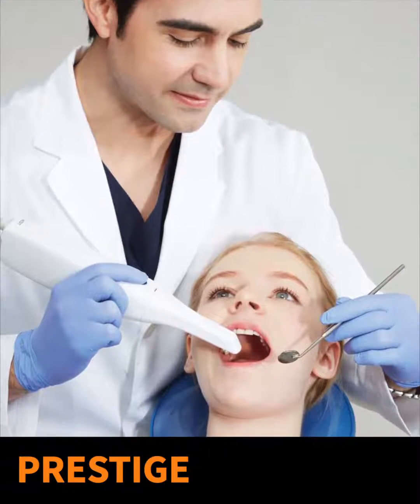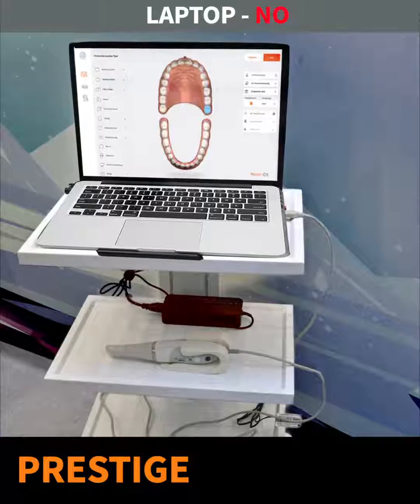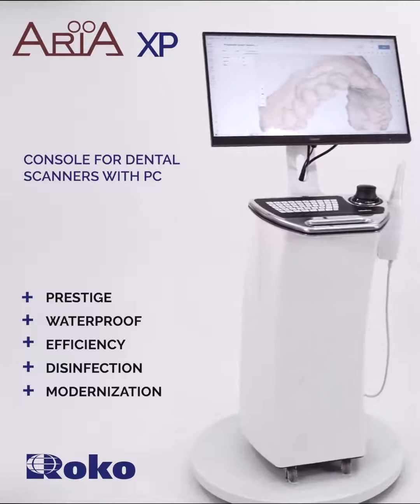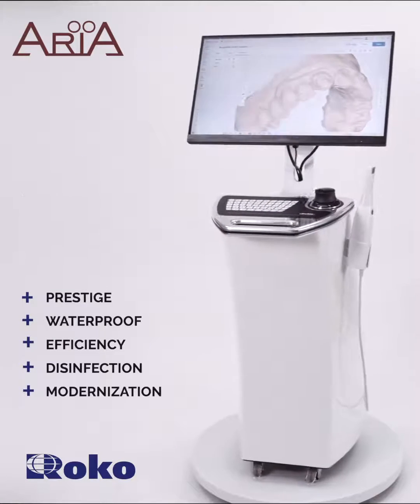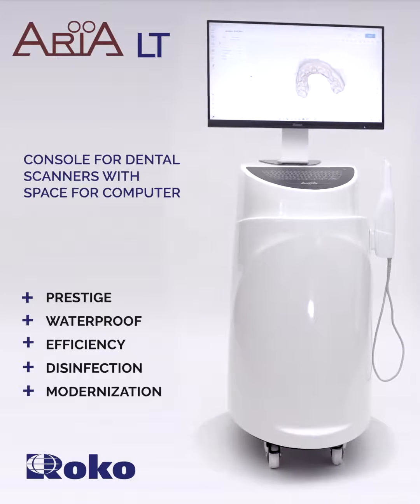Intraoral scanners mean easy work, but prestige too. Even the most expensive laptop will not be that prestigious if presented on a wheel rack. Patients rate both the lab standard and equipment quality. An elegant console will be a perfect component of your prestigious lab.